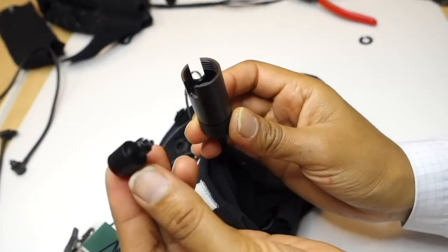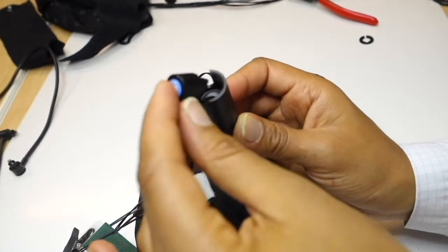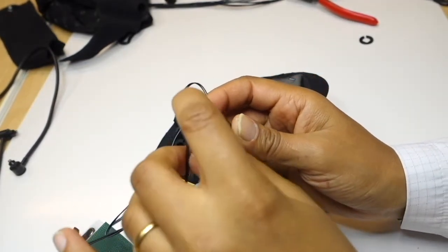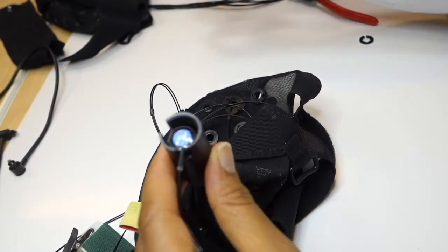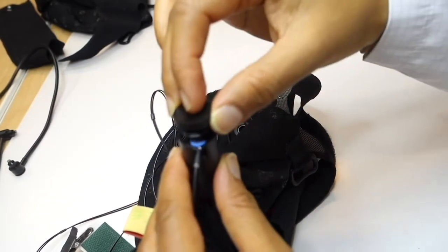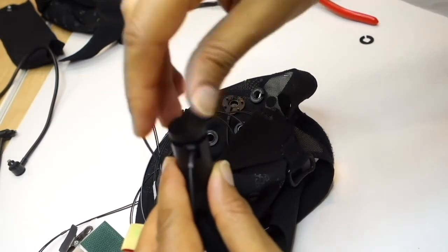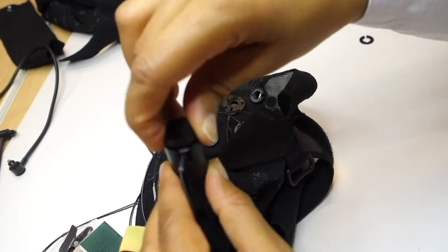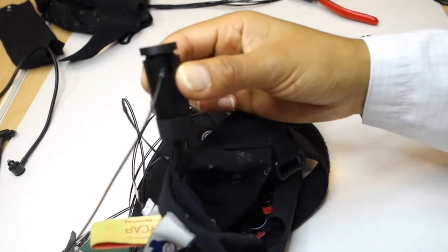And next you can insert the detector, which will be the last detector of your setup. It's not clear, but it's detector 8 in this case. This is placed in the end with internal threads. And then again, make sure the detector is fully seated. Apply the screw cap gently until you face resistance. Again, no excessive force is required.